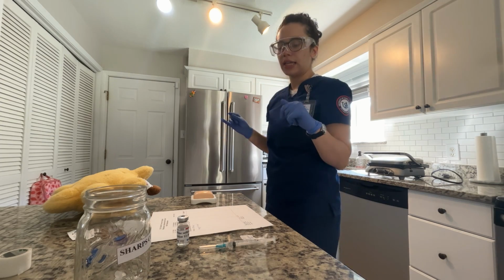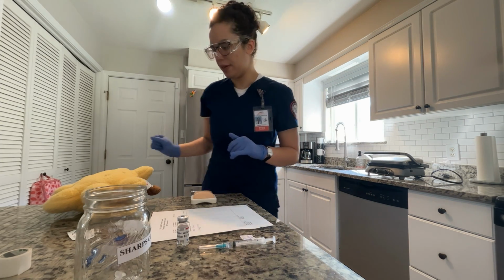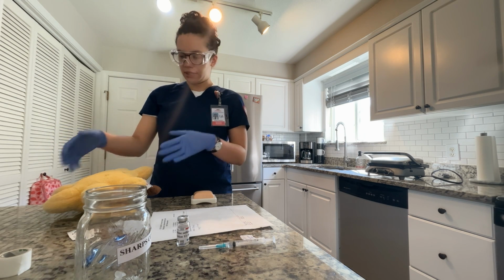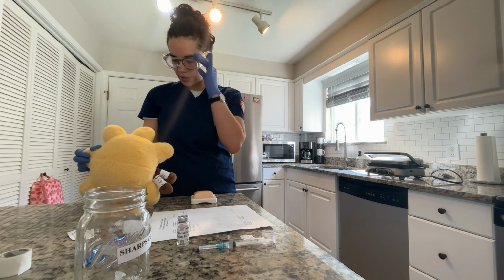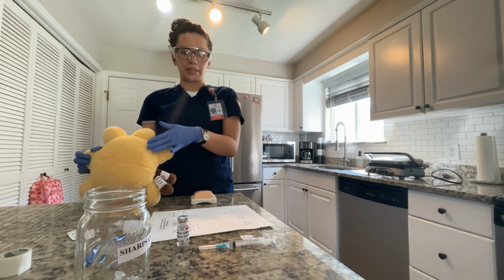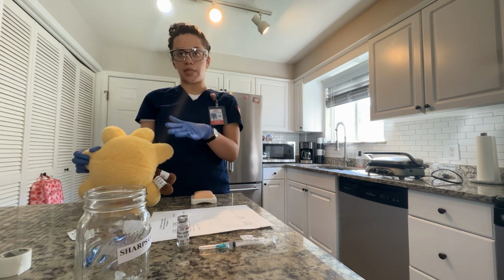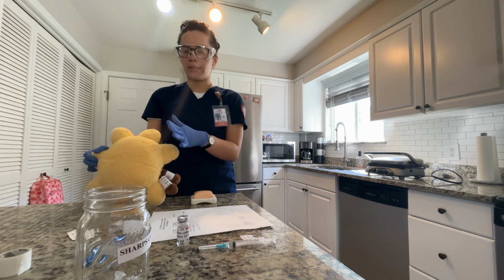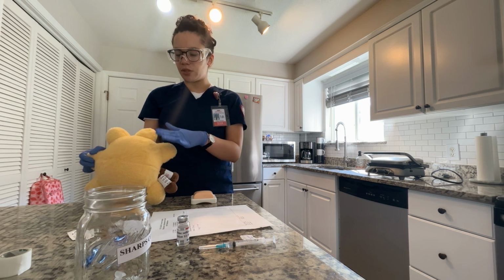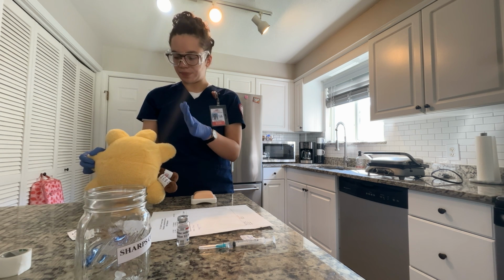So since I'm going to be giving this medication intramuscularly, I'm going to be having Mr. Jones come to his side to do the ventrogluteal intramuscular injection. We also have the options of the deltoid or the vastus lateralis, which is both subcutaneous and an intramuscular, but today, since ventrogluteal is the most preferred intramuscular injection site due to the lack of innervation, I'm going to be performing that with Mr. Jones.